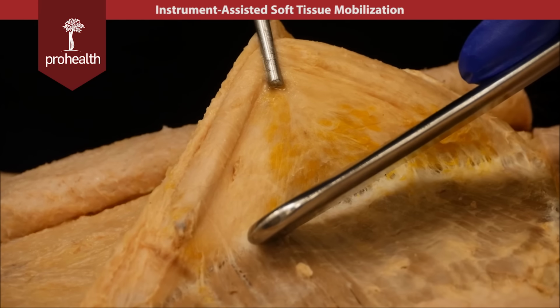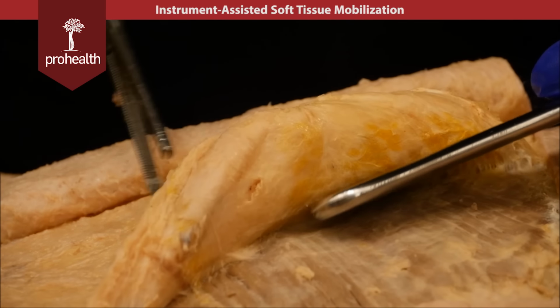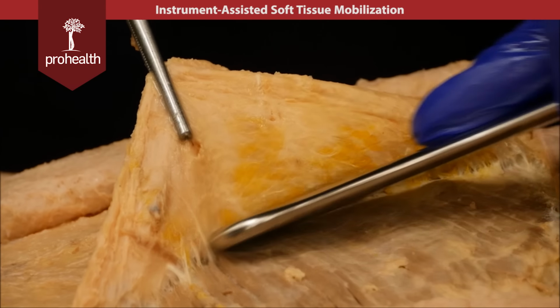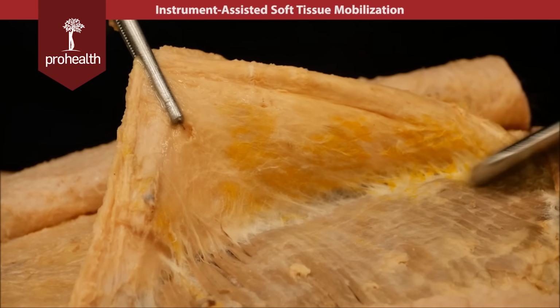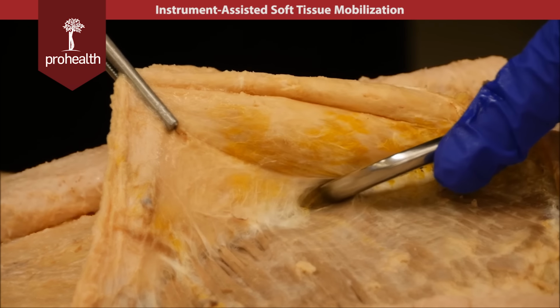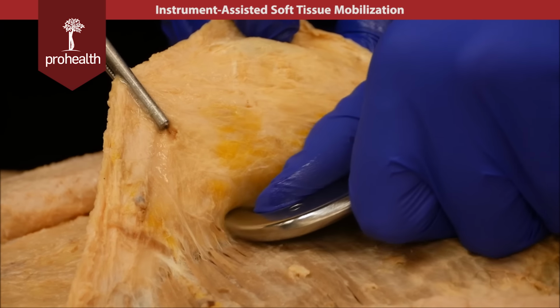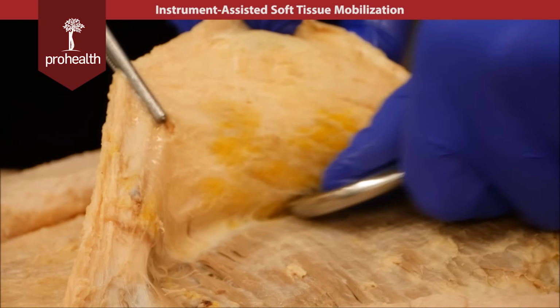Here we have a cadaver demonstration of some instrument-assisted techniques working on the superficial fascia. On the lower part of your screen, what you're looking at is actually the muscle. On the upper part of the screen, you're seeing the superficial fascia being reflected back. If you look really closely at the junction between those two structures, you're able to visualize the superficial fascia and deep fascial connection right there. With various techniques and movements in different regions of the body, you're able to release different forms of scar tissue and adhesion that will improve overall function in this region.